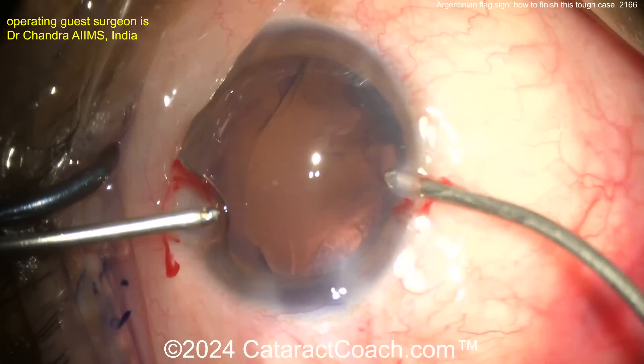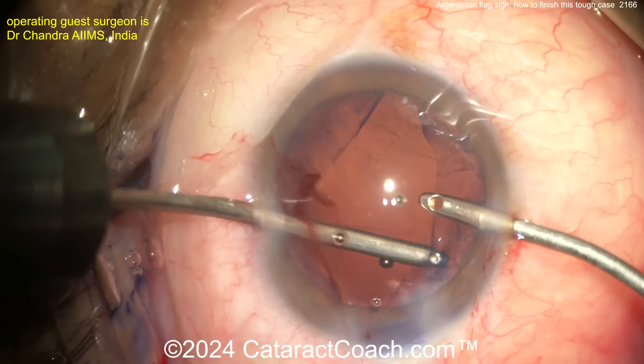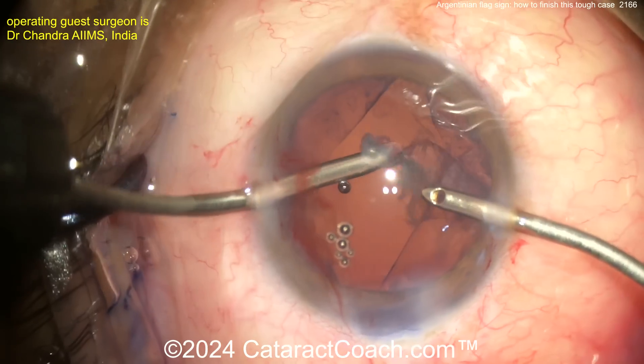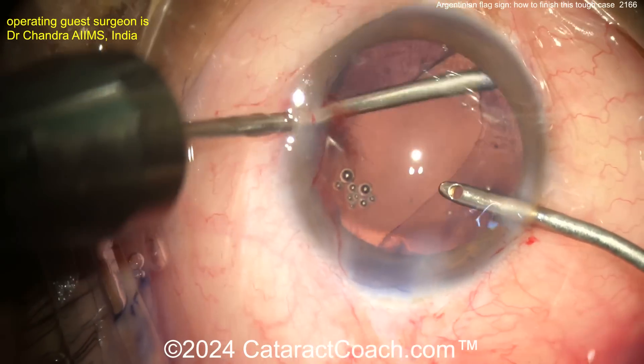The patient now is going to have a much better outcome because you're replacing that opaque white cataract with this new IOL. Let's see as the lens goes in — more bimanual. You can certainly still do the bimanual cortex move, but you can do it after you get the lens in the bag because this material is just on the lens capsule bag equator.